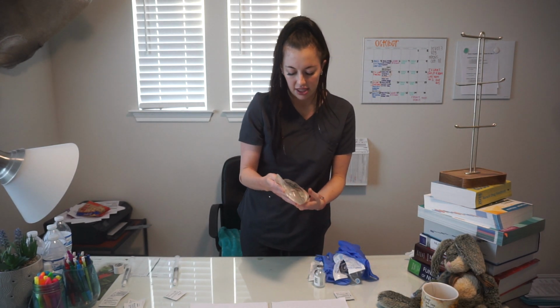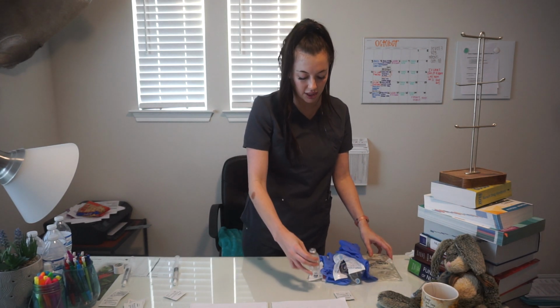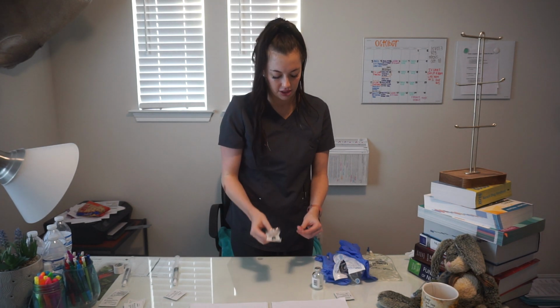The bag looks pretty good. There's no punctures. Expiration dates on both look good. I'm using a 5 ml syringe with my blunt tip.